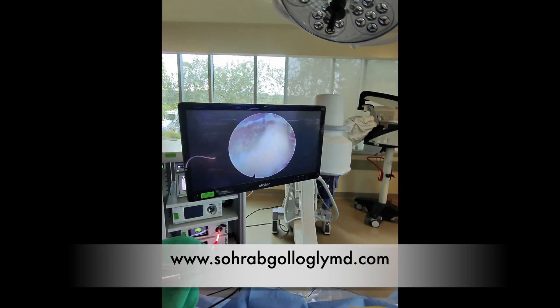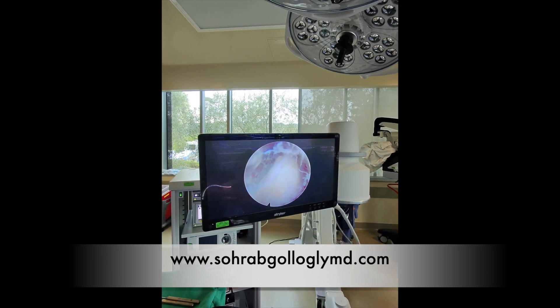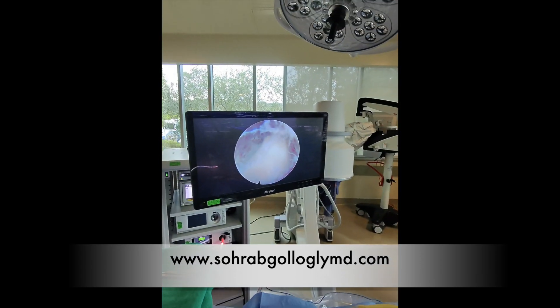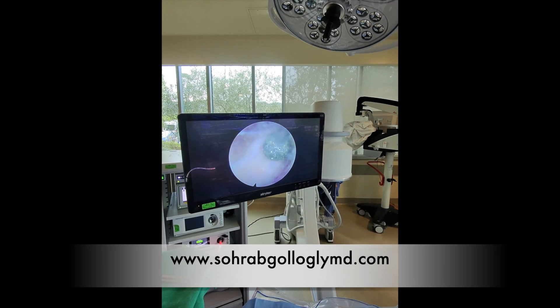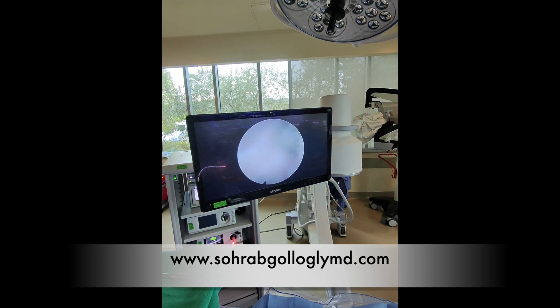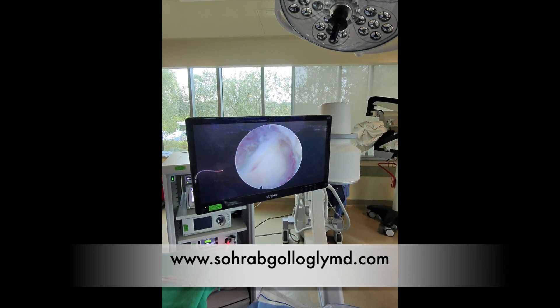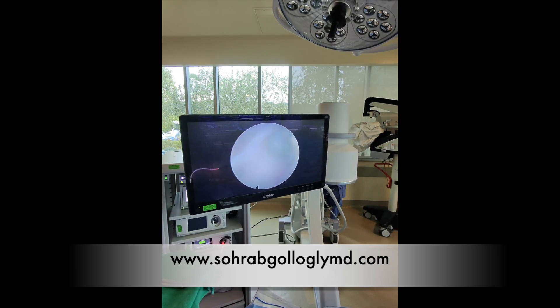Now we just need to complete this drilling all the way to the peripheral attachments of the ligamentum flavum in order to remove it en bloc. There's our midline raphé — we can see it pulsating back and forth — and we're going to insert the drill and work to the point where we get to the peripheral attachments. There we've released the ligamentum flavum all the way at the top, and you do the same out to the side.